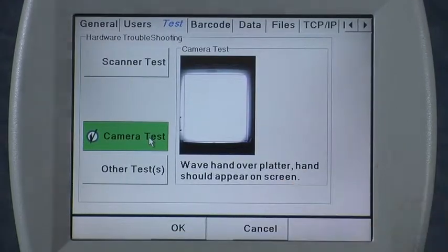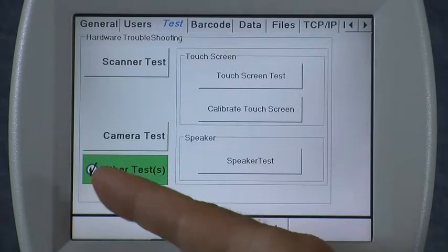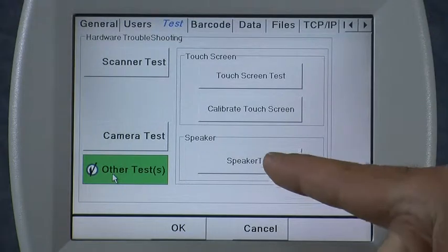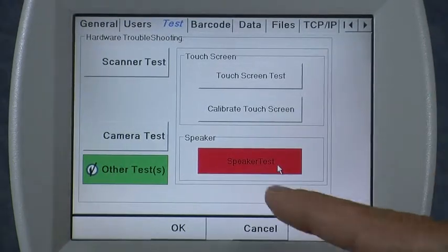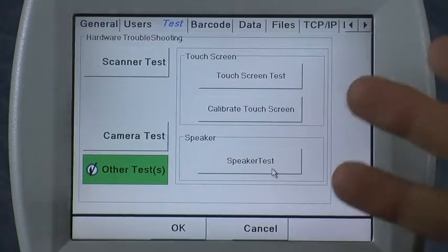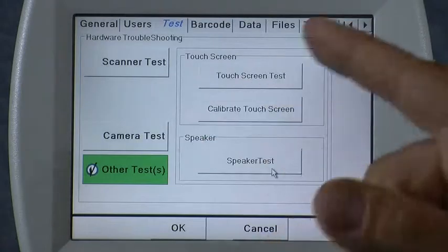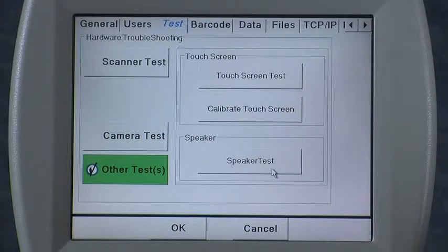The other tests include some less commonly used features, primarily to verify the operation of the speaker, as well as to calibrate the touch screen. If you're using the Eyecon and you go to touch a button and the cursor does not point to where you touched, then you probably need to calibrate your touch screen.